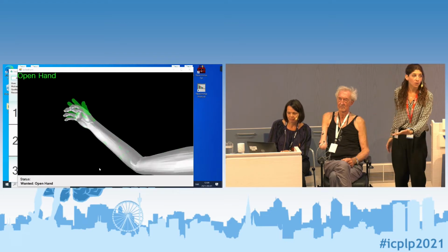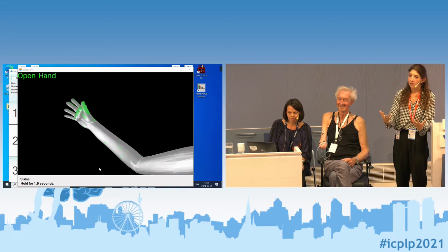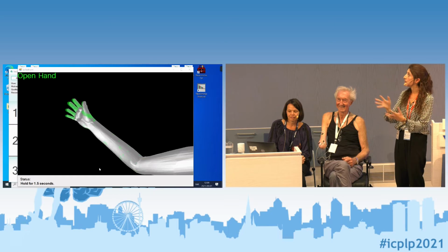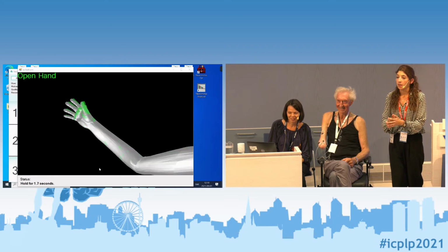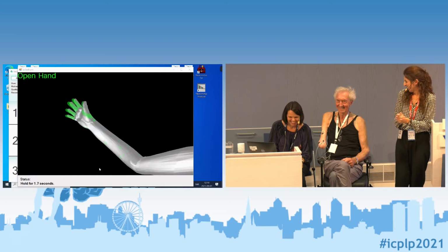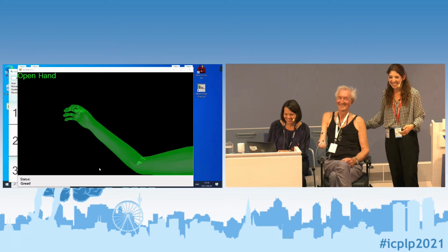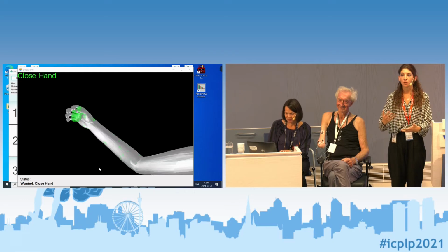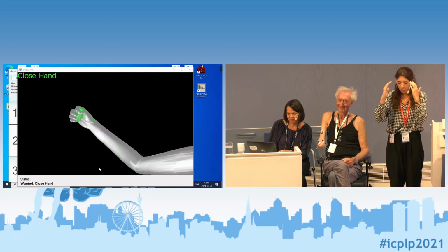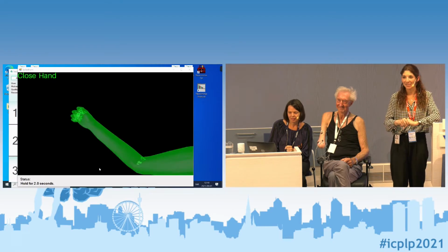So he had very good control, so as you can see, he's able to easily match the position. But of course, if there is more muscle contraction, then the target is not achieved. This is good. Many patients like this part very much because it demands a lot of attention. Here you see it's super nice, a smoothie, but it's not the case.